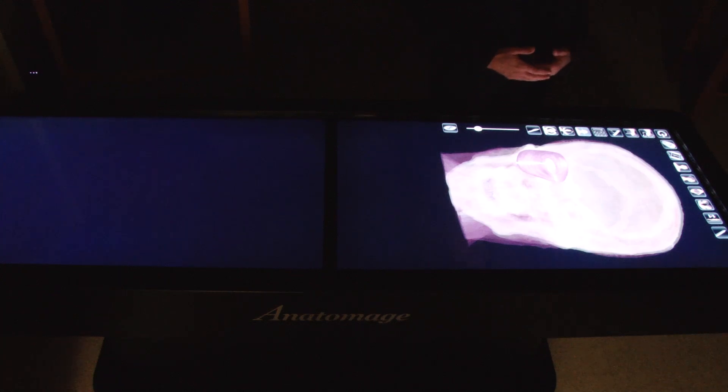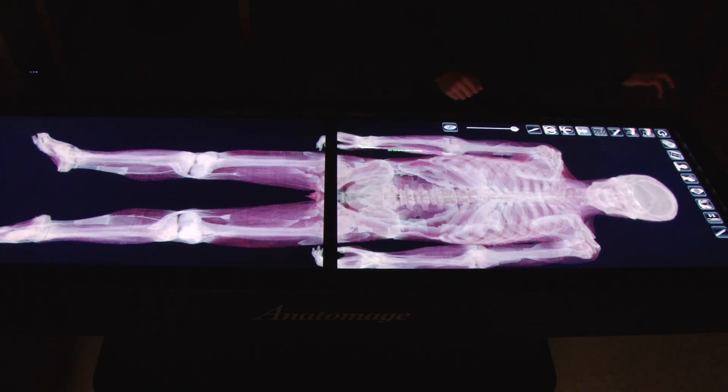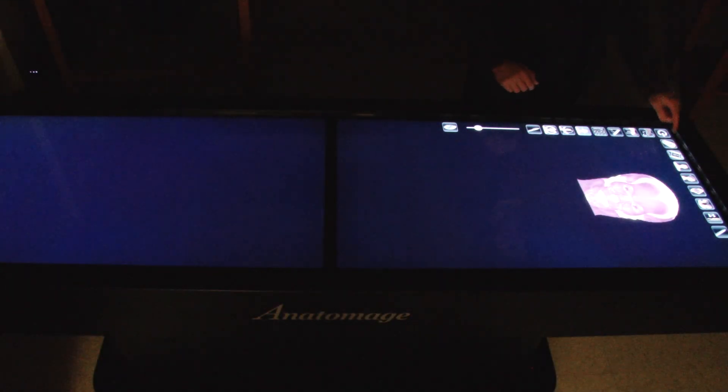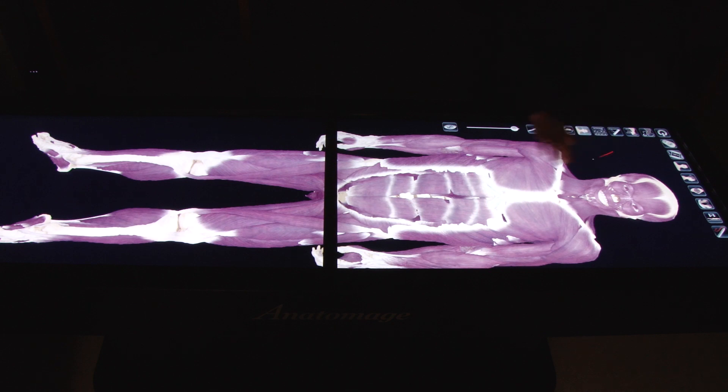They are able to annotate structures for quizzes and self-study. They are able to individually ghost image a structure relative to other structures, as you see here. And the table will identify those structures for the student if they are having trouble.